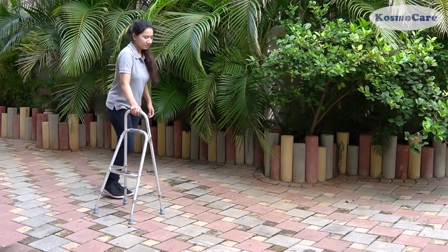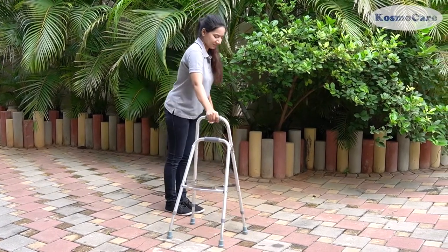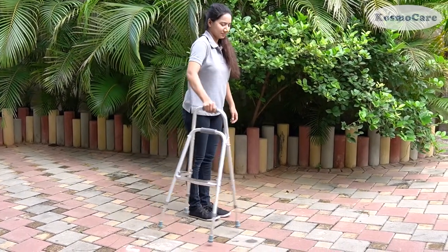So, help your loved ones to walk independently, and give them the confidence and stability they need wherever they go, with the Hemi Walker from CosmoCare.